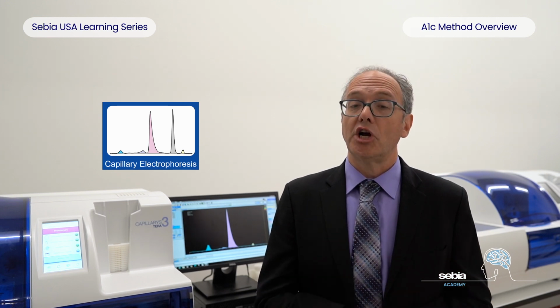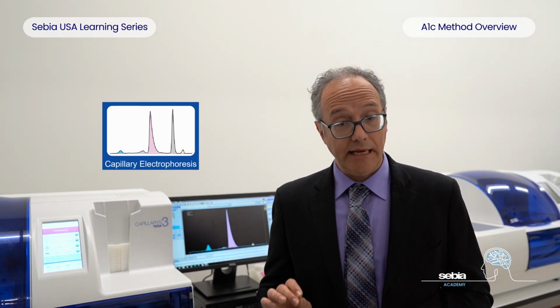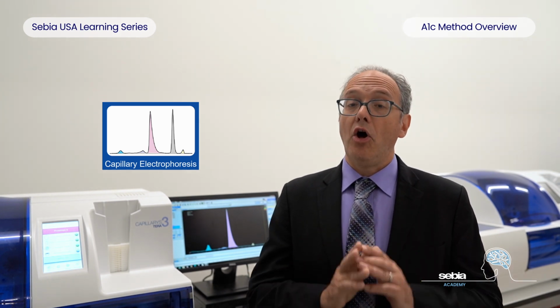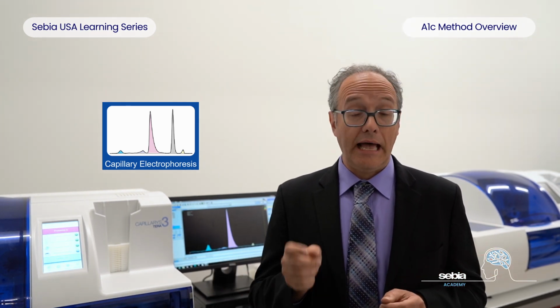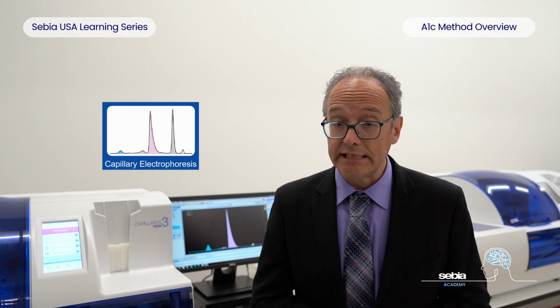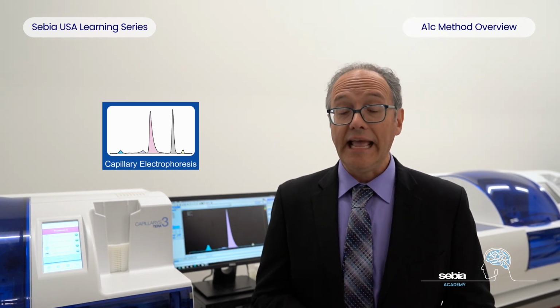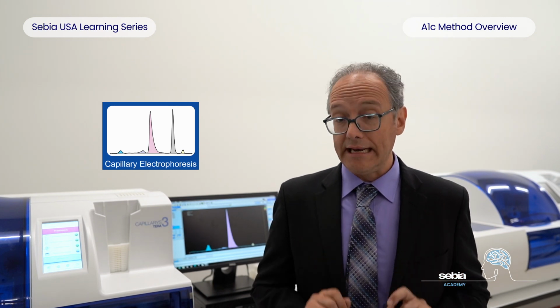CE is a method used to measure hemoglobin A1c, which separates hemoglobins based on their size and electric charge. It, like HPLC, also presents a pattern result showing all patient hemoglobins. However, capillary electrophoresis provides this improved result with better resolution in a faster and more automated manner.